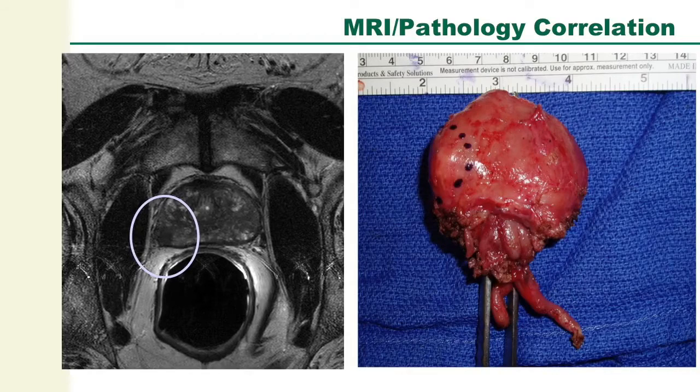In that right peripheral zone of the prostate, there's an area of suspicion which was identified on MRI. This patient underwent MRI ultrasound fusion-guided biopsy with demonstration of a pathologic finding of cancer in that targeted region. And subsequently, the patient went on to a radical prostatectomy, one of the surgical options for definitive management of their prostate cancer. And the area that's denoted on the specimen on the screen there is the area of cancer that corresponds directly to the area of imaging done months before.